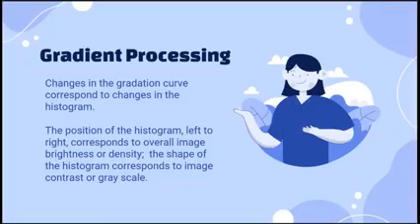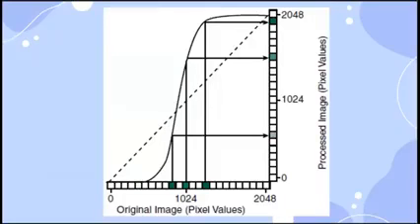In other words, from a graphical standpoint, the histogram from the actual projection is moved and reshaped until it closely aligns to the reference histogram. The final display of the image is the result of this realignment. Okay. For example, this is your H and D curve or histogram.